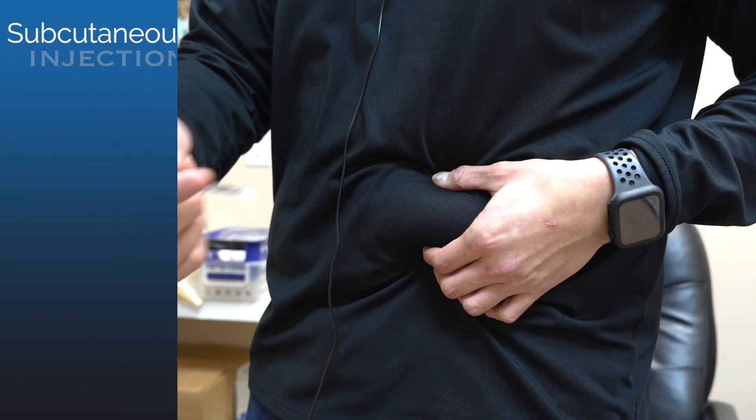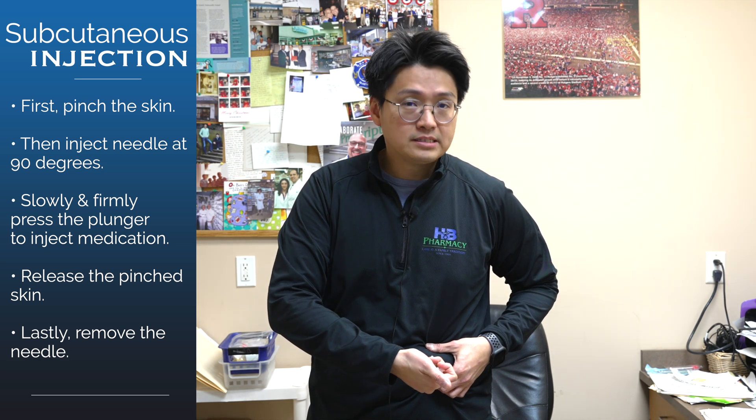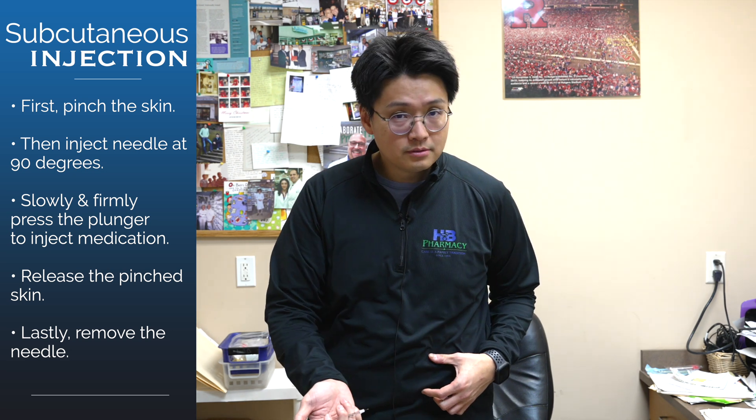When you inject yourself, you are going to pinch, go straight in, and press the plunger all the way. Wait a second, and then pull it out.